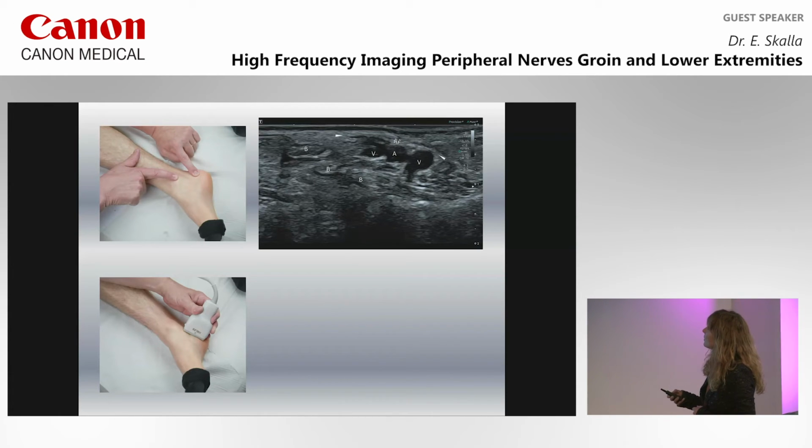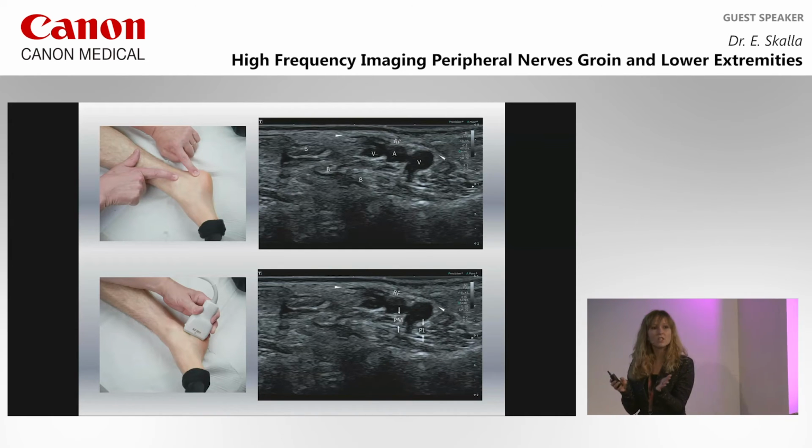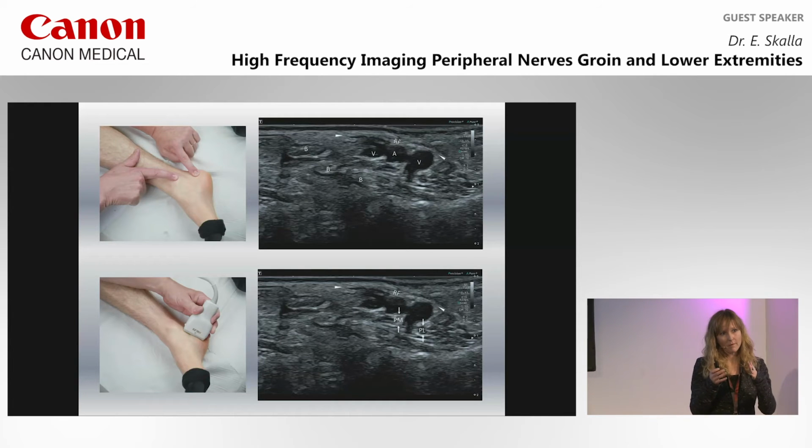And there we see two cross-section areas of the nerve. It's split already. The medial and the lateral nerve just after the division. As a variation, you could see the main stem going more distally, so a deep division into those two nerves, and you could see in the tarsal tunnel just one nerve.